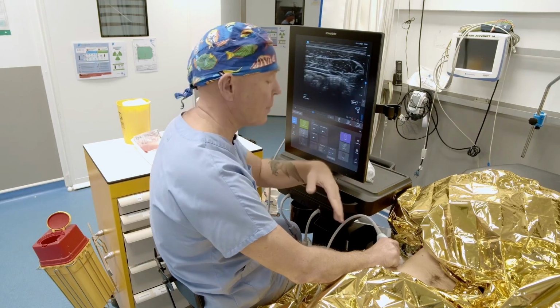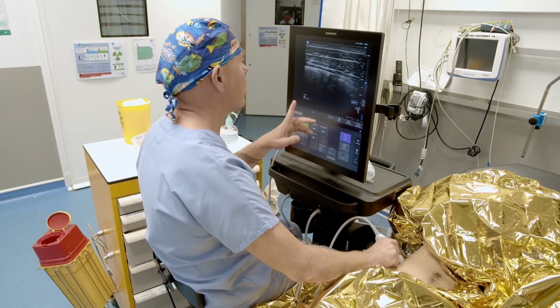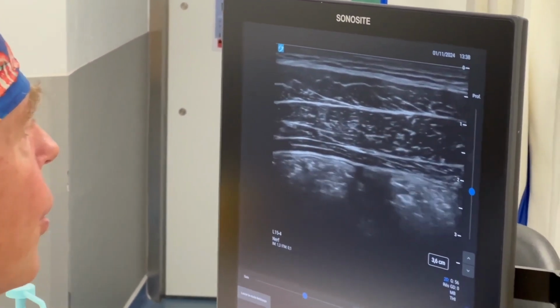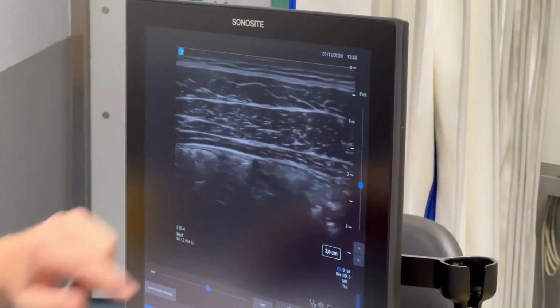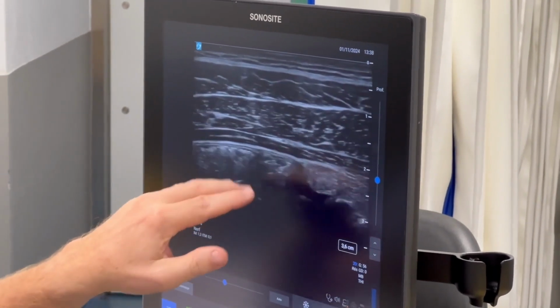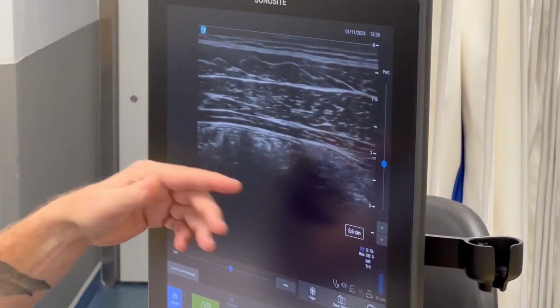Afterwards, your effectiveness will depend on where you position your probe. A little tip. Sometimes in slightly overweight patients or those with a fatty pad, counting the layers can be a bit difficult. I recommend starting from the inside with the intestines. The intestines are easy to recognize because they move. And then you'll know that your tap block is the second to last layer.